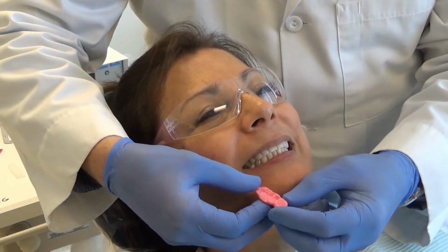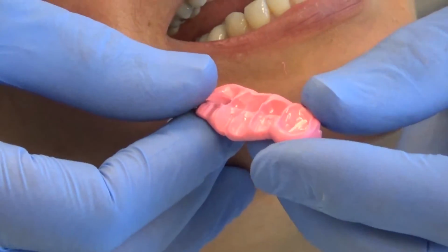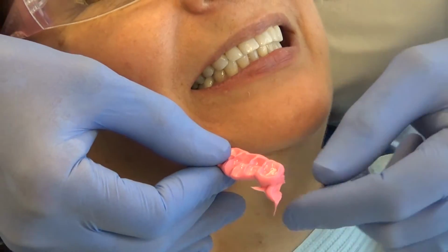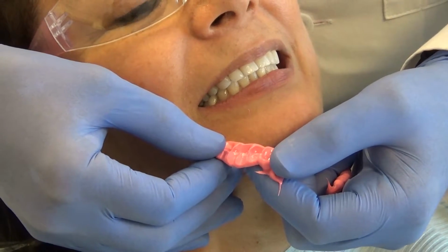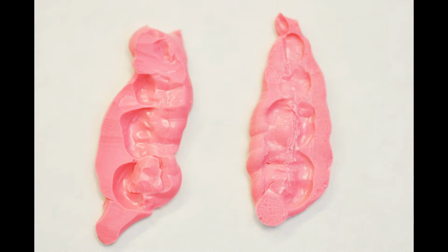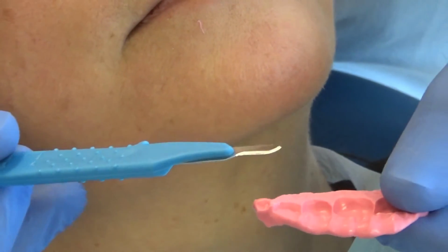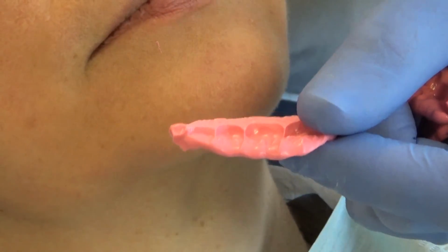Now you'll notice that I used enough material to get a good registration. But the key in using this kind of a registration is you have to trim the excess back down to where only cusp tips are showing on the bite registration. You don't want any amount of material beyond just the cusp tips only. And what you're going to use to do this is a number 15 blade to do the trimming. And then once you have that trimmed back to just the cusp tips, your record is finished.